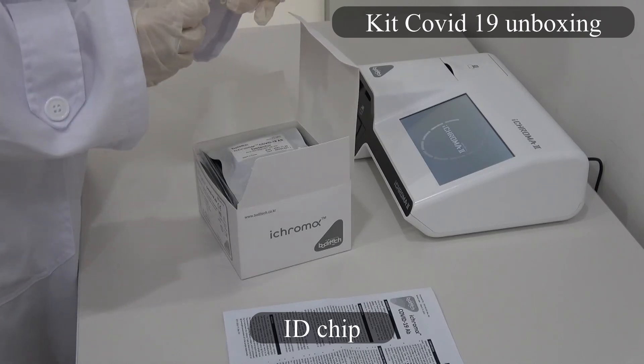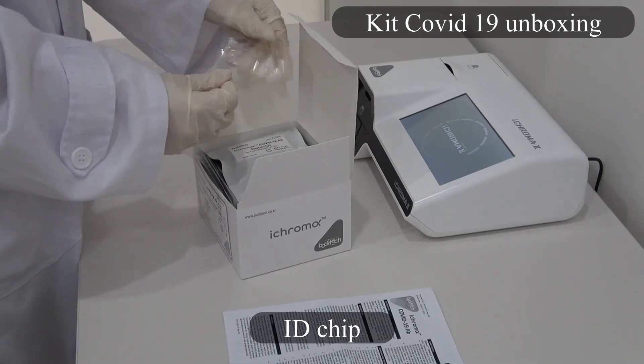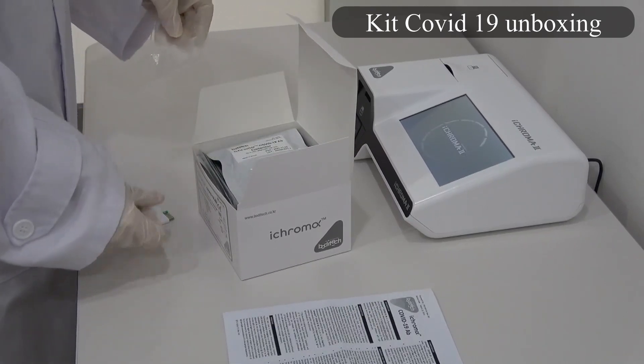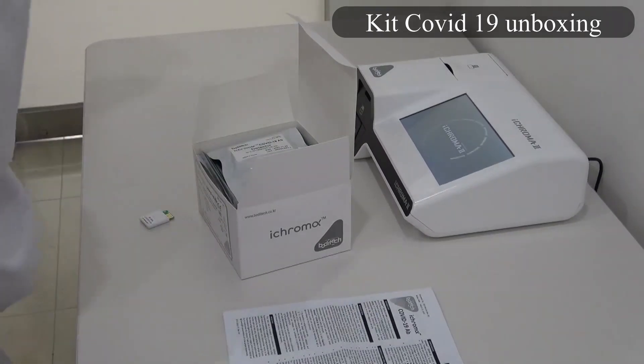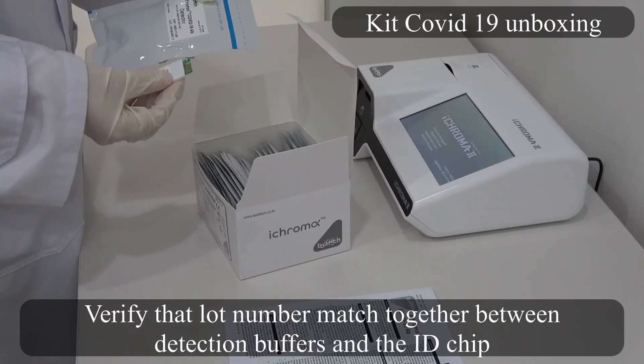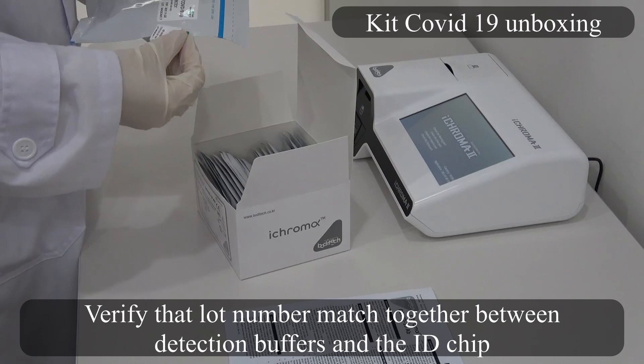ID chip. Verify that the lot number matches between the detection buffers and the ID chip.